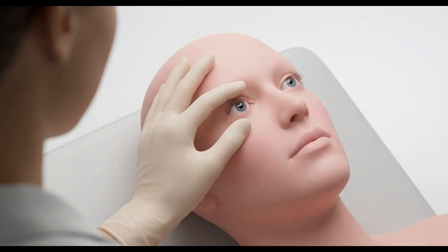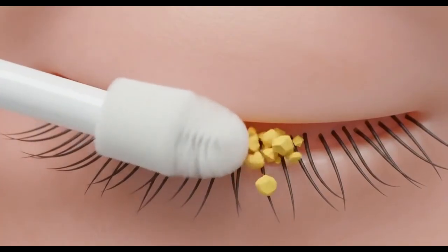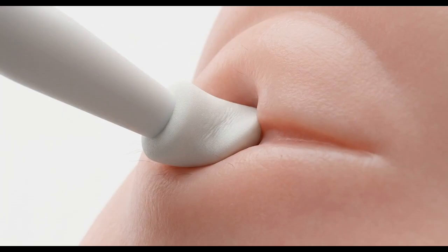Have the patient lean back and look up. Use your non-dominant hand to gently pull the lower eyelid downward, securing it firmly in place. Apply the spinning microsponge directly to the lower lash line. Notice how the rotation actively clears away the scurf, dead skin, and accumulated debris. The most common error clinicians make here is being too gentle. You must apply firm pressure across the entire width of the lid margin.